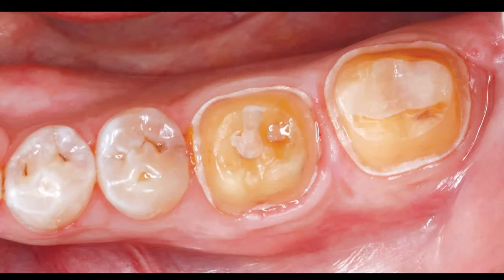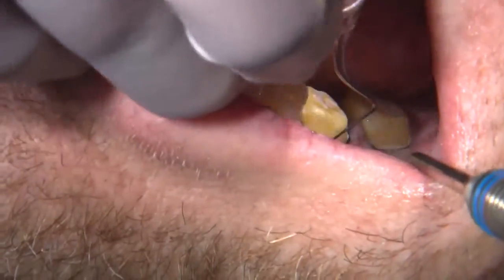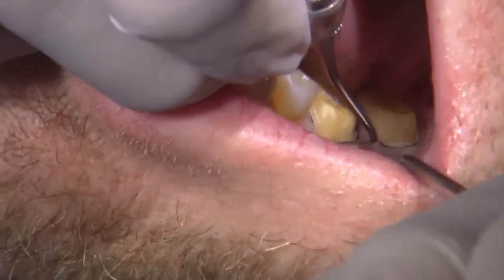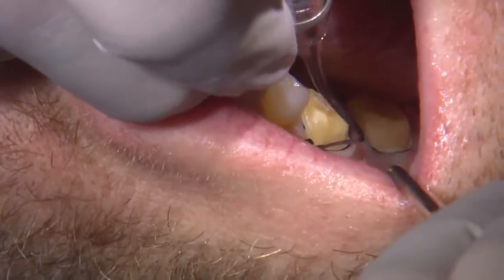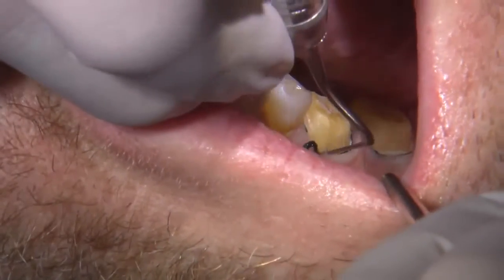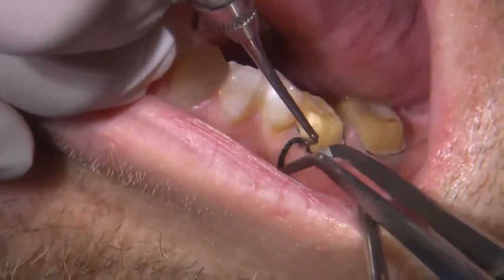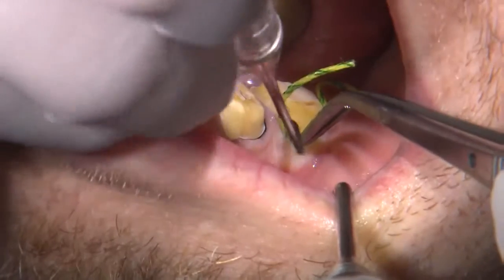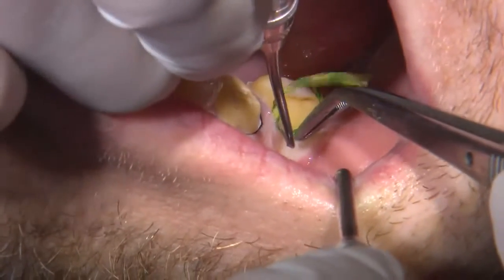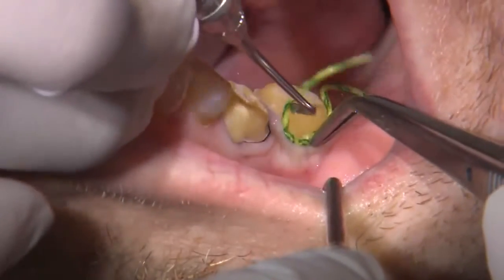Enough reduction occlusally and axially, and then once that is taken care of, a very important step that should never be overlooked is gingival retraction. Here I'm using a double cord technique. The first layer is a thinner 00, and that will help displace the gingiva apically, and a second layer of cord is applied right on top of that to help displace the tissue laterally. We need to create some form of separation, not just for digital dentistry, but in dentistry in general.